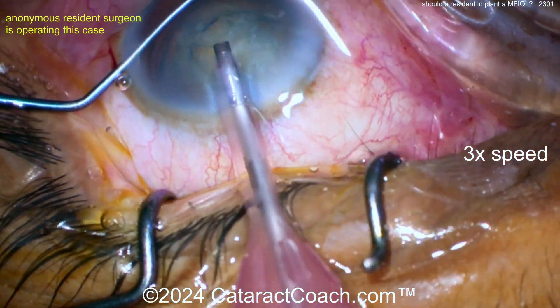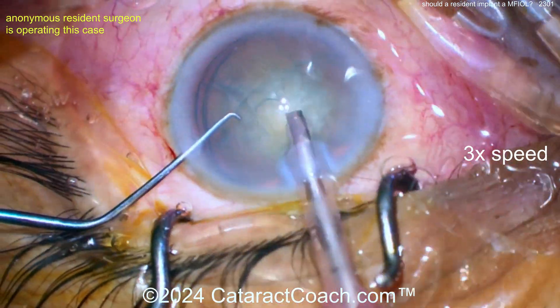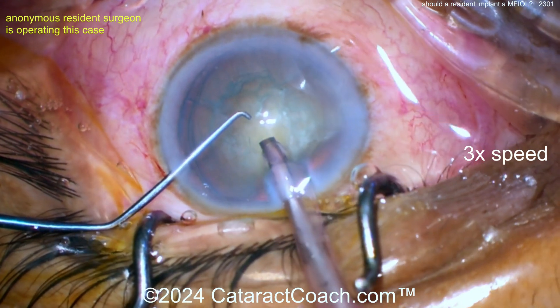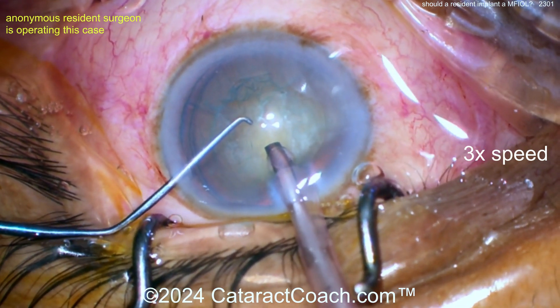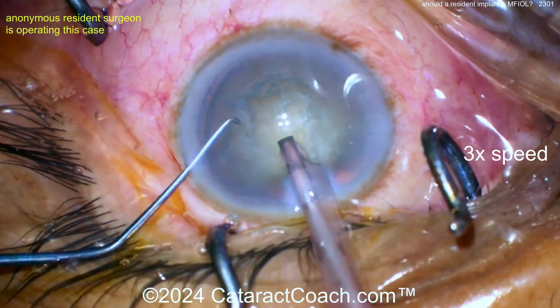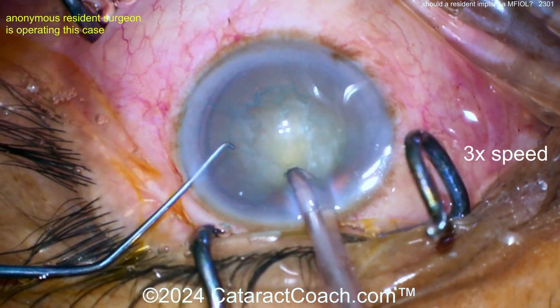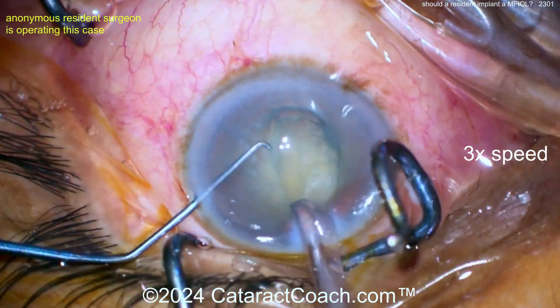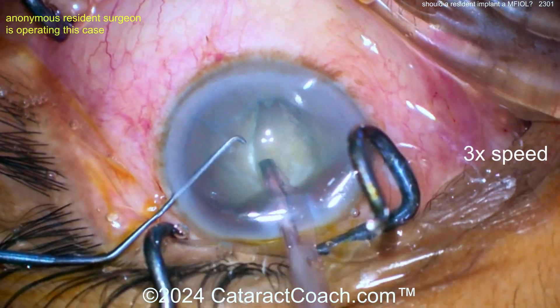The phaco probe is going into the eye — finding that incision, there we go. Let's see the technique cleaning up the cortical material. What do you need — chop it, buzz into the probe maybe? And the speculum — look at the speculum, it's all over the place, it's popping off the eyelid. Grooving down the middle — you've got to fix the speculum.